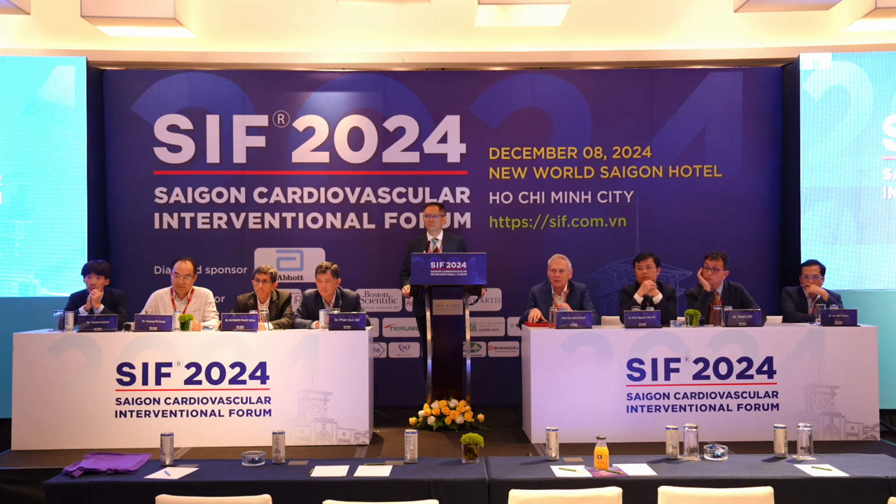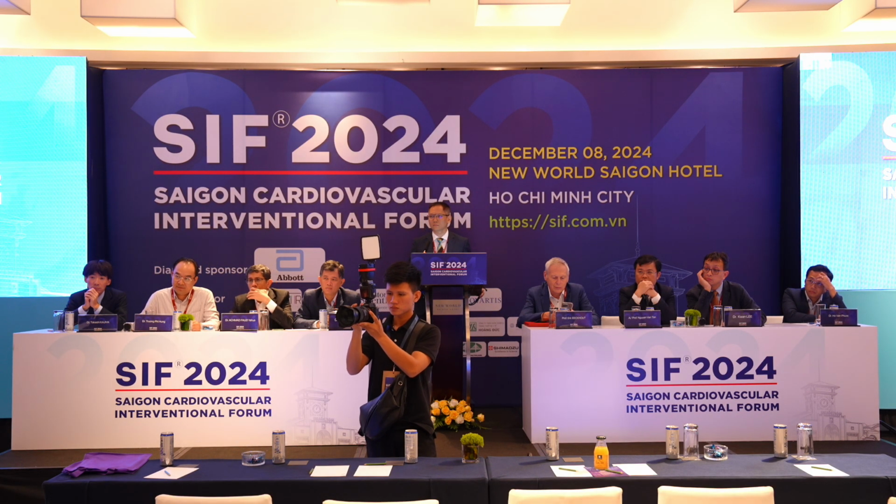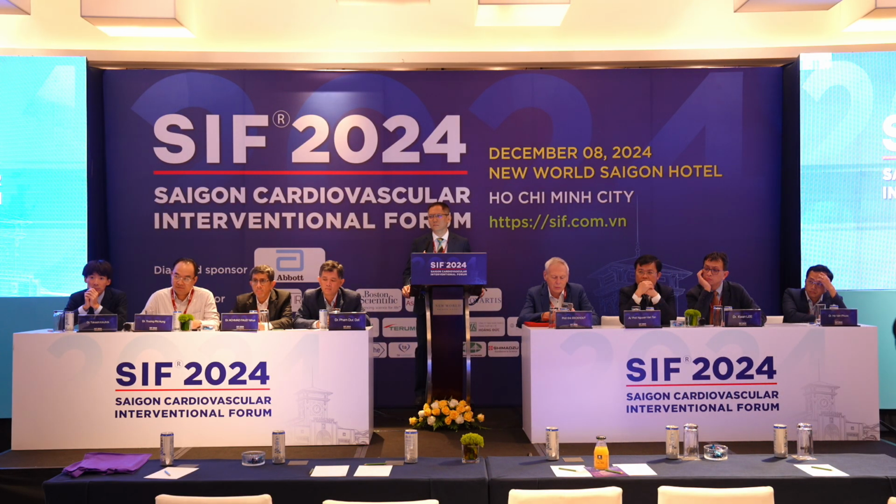So I would like to ask about the tips and tricks to aspirate the thrombus. In some cases, when we try to aspirate and then we use a balloon from a small balloon to a bigger balloon, but we cannot aspirate. How can we do it next? In my center, sometimes we use a fibrinolytic with a small dose to inject to make it into small particles, and after that, sometimes we can aspirate everything.